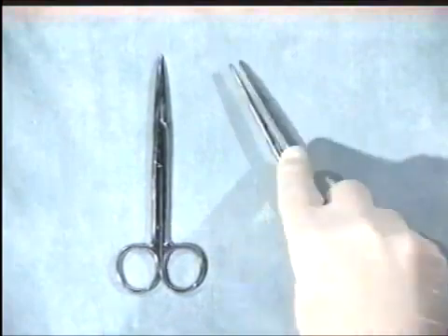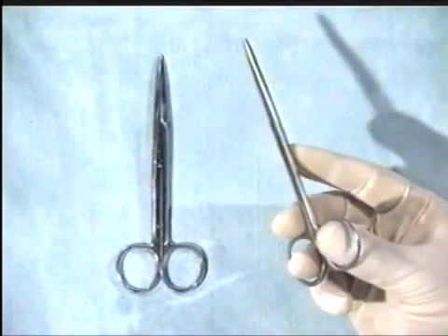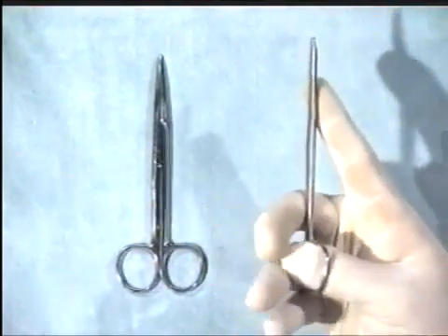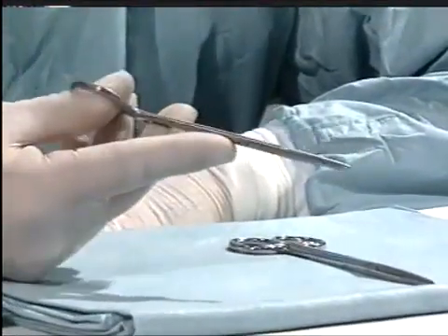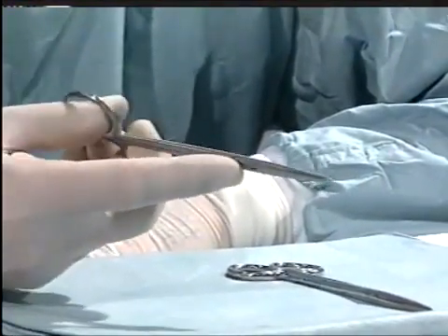Hold the scissors with just the tips of the distal phalanges, with thumb and ring finger in the rings, steadying the scissors with the index finger and the middle finger. Never put your fingers right the way through, as this makes it difficult to extract your fingers from the instrument. By using just the distal phalanges, you get very good control for accurate dissection.